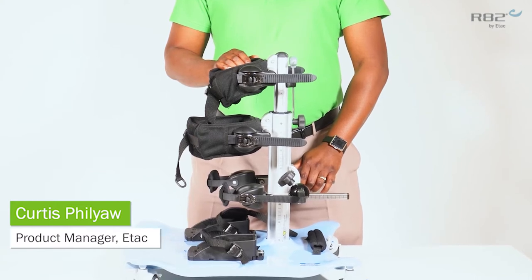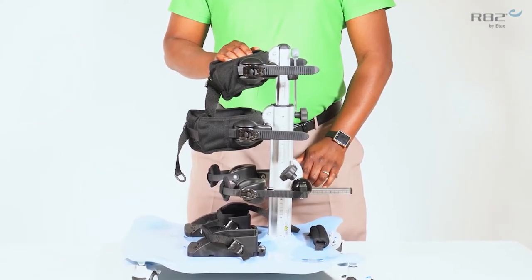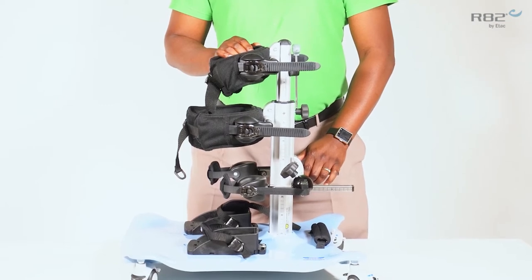The Meerkat is an upright, static stander with a dynamic feature. The Meerkat is available in three sizes.